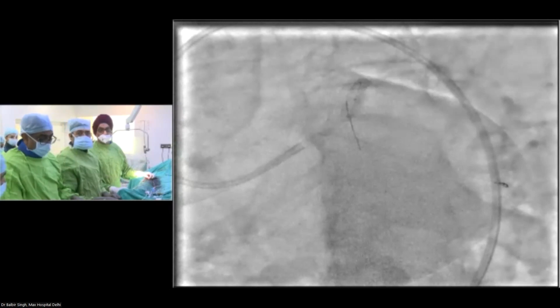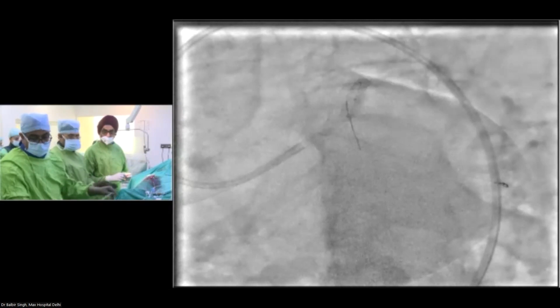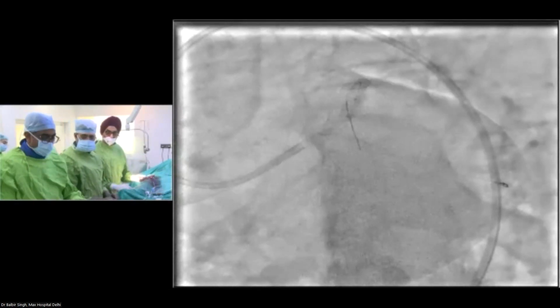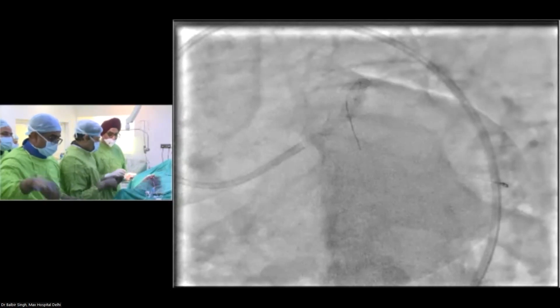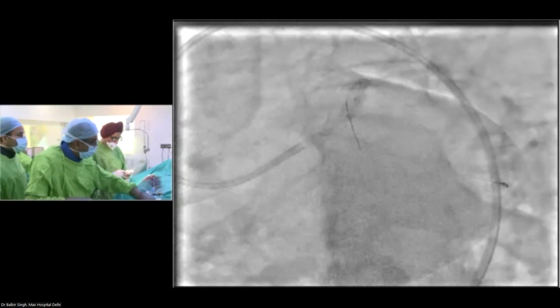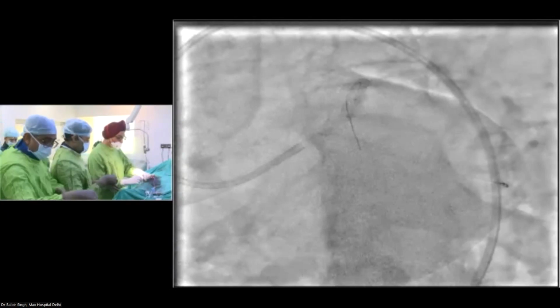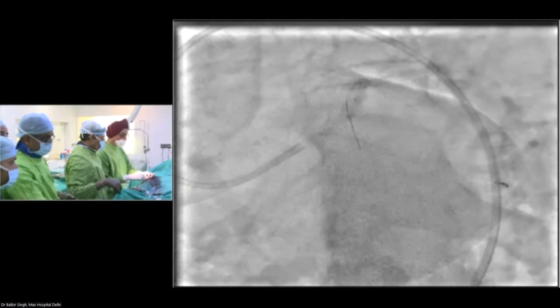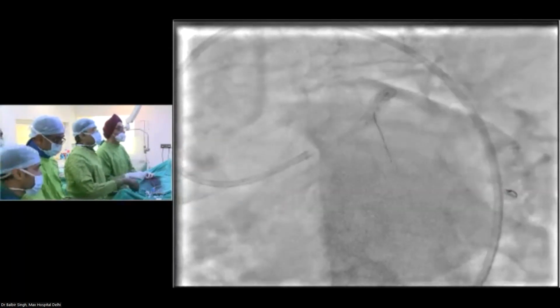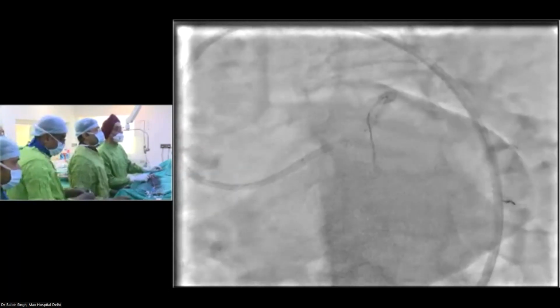I don't think the difference in a 1.0 and a 2.0 balloon is that much in profile. I think you might be better off going with a microcatheter. Okay, so let's first take one. I think in smaller balloons, your marker is in the middle, and that makes the difference in crossing. Typically it's 20 millimeters, so you wedge it in, so you have at least 10 millimeters as far as it'll go with the middle marker. 6 on LAD. 8.